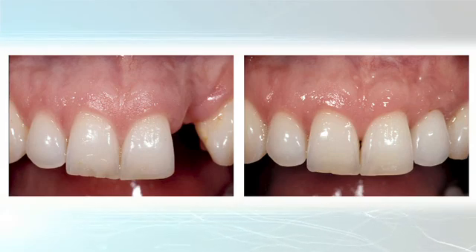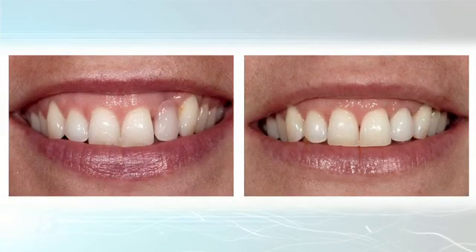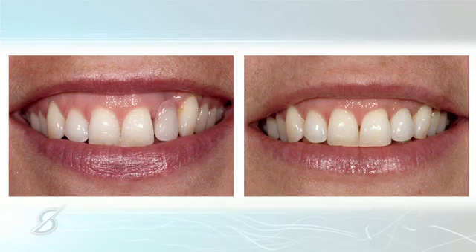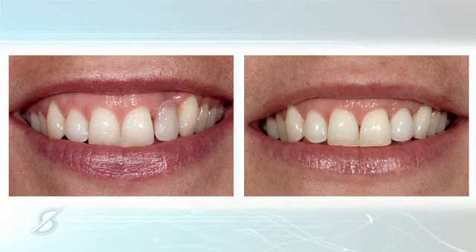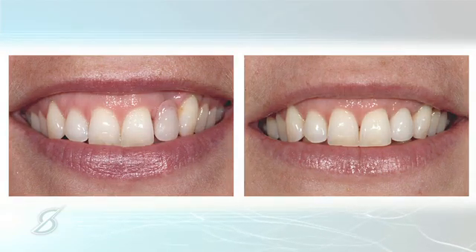So yes, there are times that I do gingivectomies on implants, but it's almost always a case that's had a connective tissue graft that really thickened the tissue up, and my temporary contour simply isn't adequate to change the shape of the tissue. And you can see with her high lip line, it's really important we got the contour of the gingiva around that left lateral implant to match that natural right lateral. So as I said, to me this section is a critical section for people doing single tooth anterior implants. We have to know how to manage contour so that the contour dictates the form of the tissue.